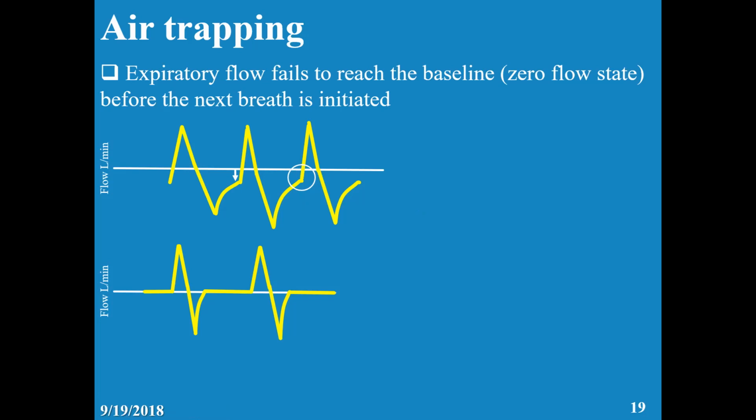Remember, it should start from zero, not like here, starting from below, and it should go back to zero. And that's what we call air trapping. Is that clear?